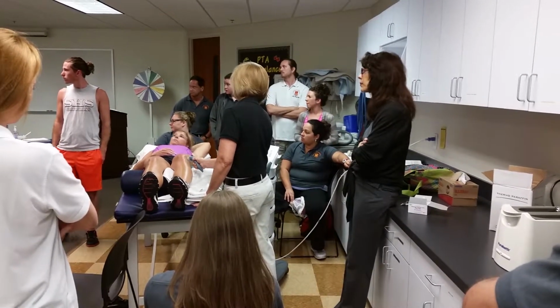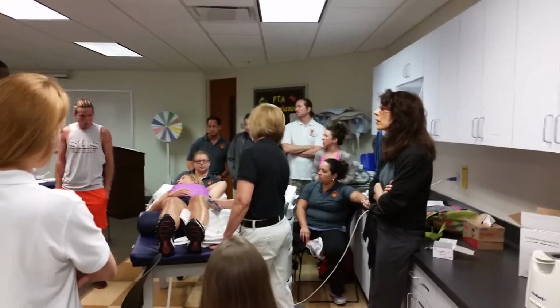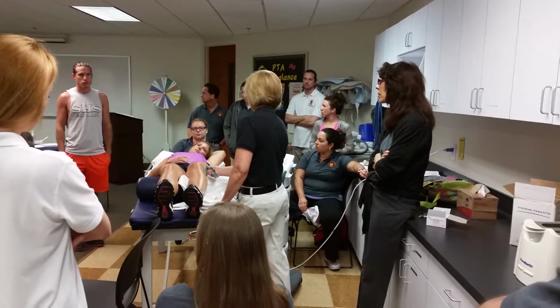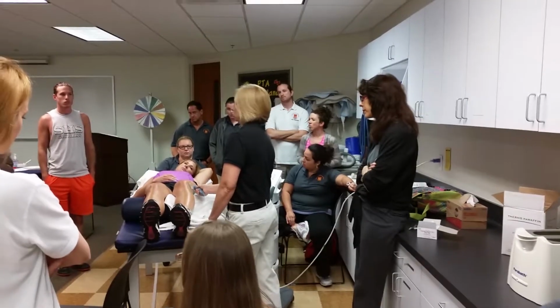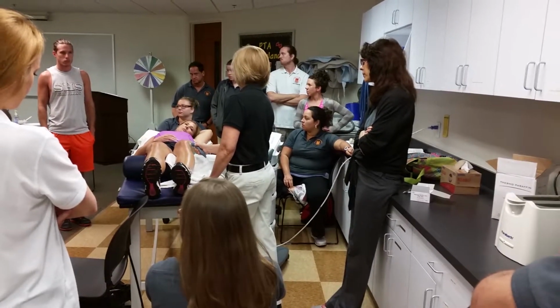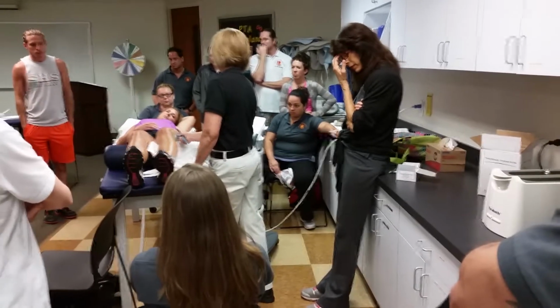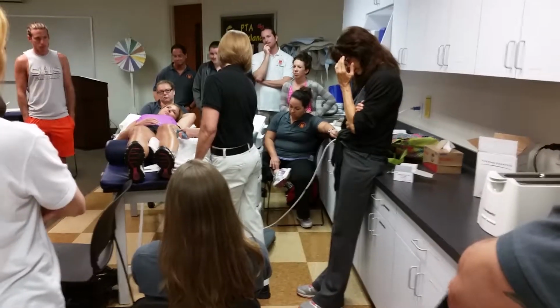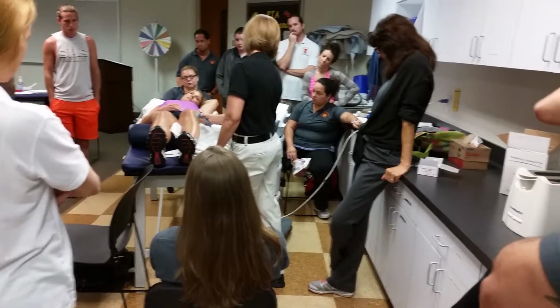Sorry to interrupt. You said it was IT band syndrome that you're trying to treat. Would this be the modality that you would choose to use? Yeah, because it's fascia. It's a fascial tissue. But you said it's more superficial fascia, correct? Yes, that's why. It's right underneath here. When I push on it, in general, a person would say, ow. It's very superficial.